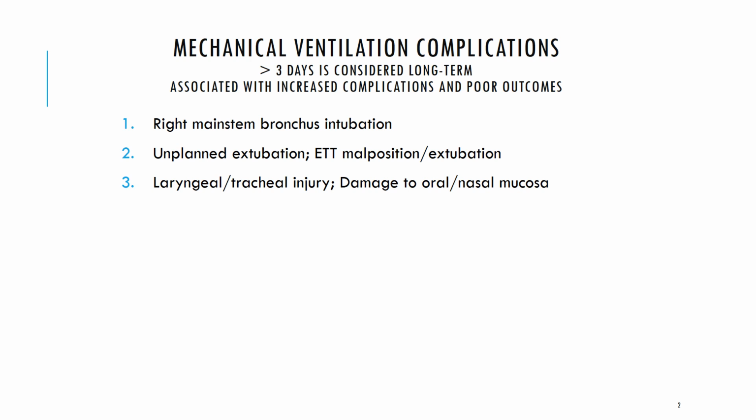Additionally, after being in the trachea for so long, our patients are also more likely to suffer damage to the trachea, to the larynx, or inside their mouth and their nose. Now, your patients are also at risk for suffering what's called oxygen toxicity. And yes, we can have too much of a good thing. When the partial pressure, or the amount of oxygen in our bloodstream, gets too high, your patient develops what's called hyperoxia.